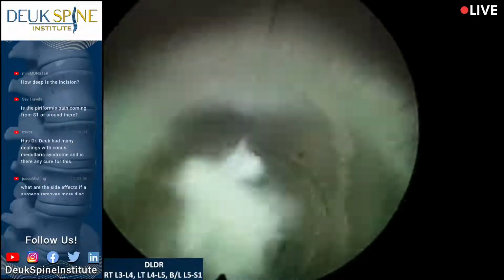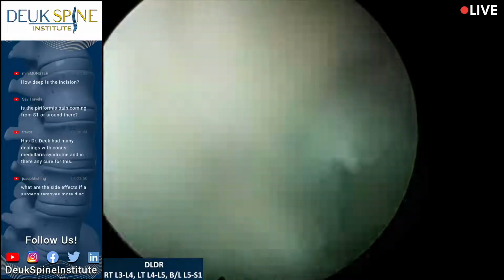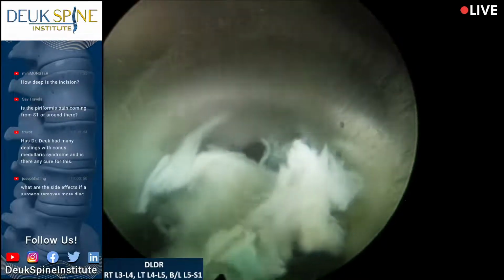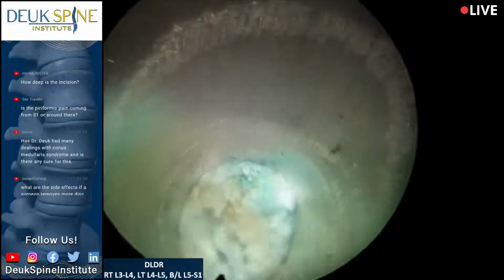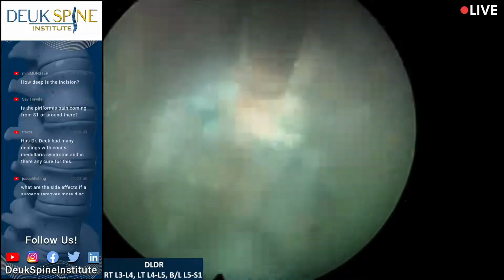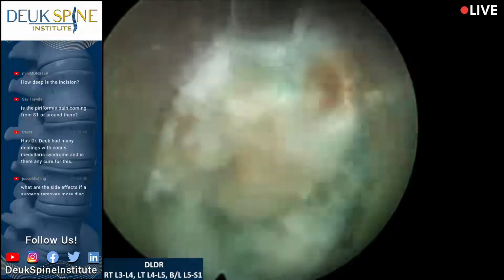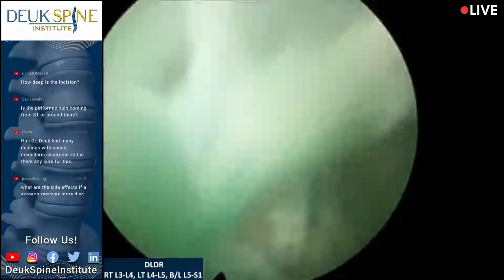We got a question from YouTube. How deep is the incision? Great question. The skin incision is only a few millimeters deep, but the actual tube that goes from the skin all the way down to the bad disc and into the tear that we're repairing right now is a good 6 to 8 or 9 inches deep. It just depends on how big the patient is. Some patients obviously have more soft tissue between the skin surface and the spine. Others have less. This particular patient has about 8 inches from their skin down to their spine. I think that's what you're asking me.